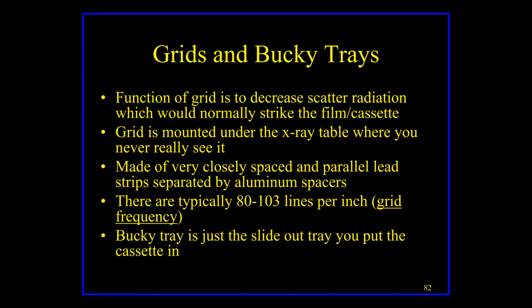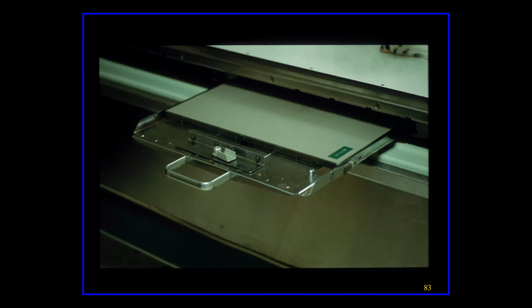And the grid is built into the table. You won't ever see it unless you start taking your table apart. But the grid functions to clean up and improve the image quality by cleaning up scatter radiation. That's all you probably need to know about that.